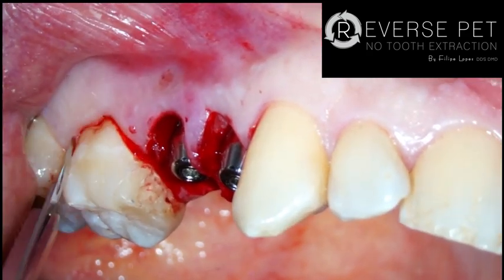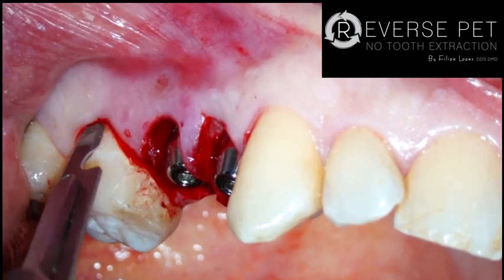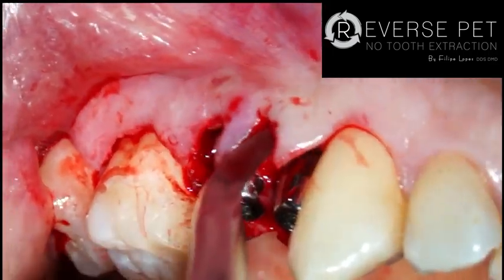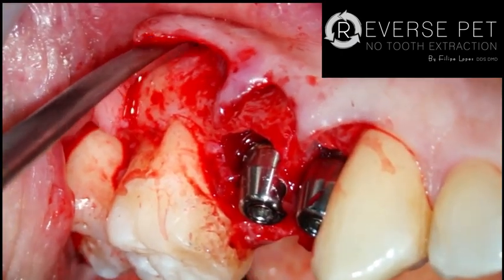And now I'm approaching the rest of the cyst, okay? That's what I'll be doing. So only now, after I have scanned the implant position, this is very important. Only after having scanned the implant position will I proceed with my surgery and go on and approach the cyst. Okay, only now. So I'm raising a flap, very carefully raising a flap because I don't want to ruin this gingival architecture, which is awesome.